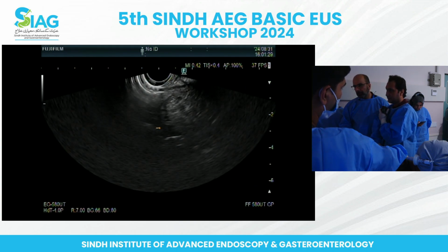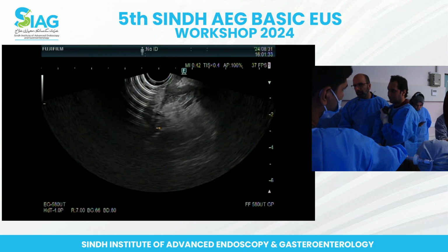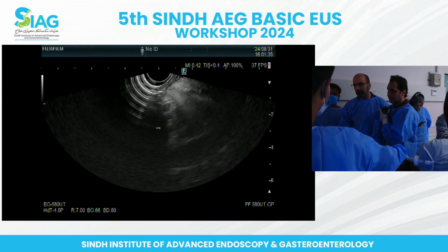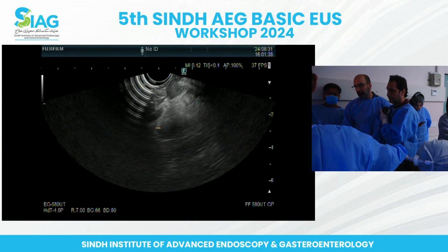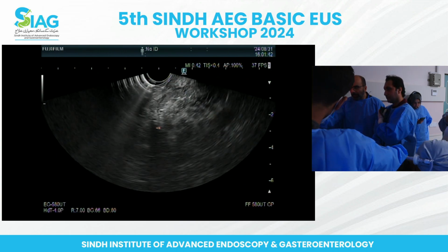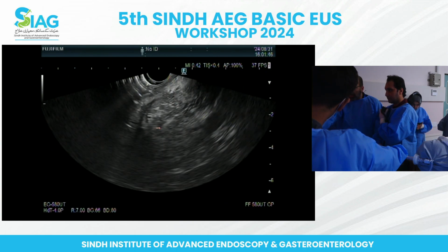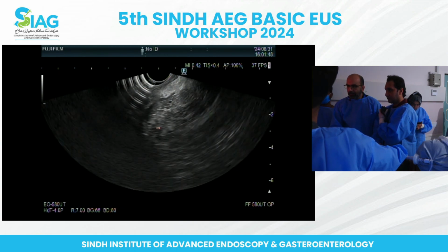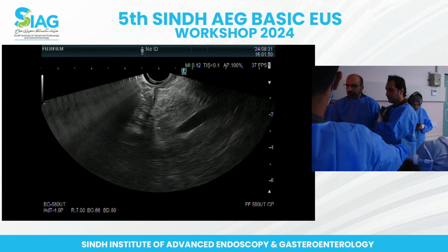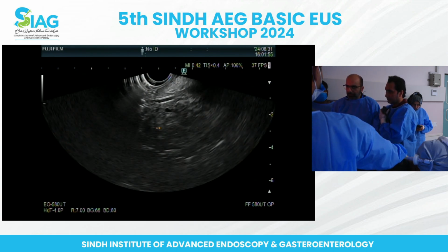Go the other way. Go more, it's okay, go more. You do get unstable, but okay, stop there, now go the other way. Back towards the PD, so go clockwise. And pull back more. Bring that pancreatic duct down here. Relax the big wheel a tiny bit. Okay, now go counter, find that duct. There, okay, good.